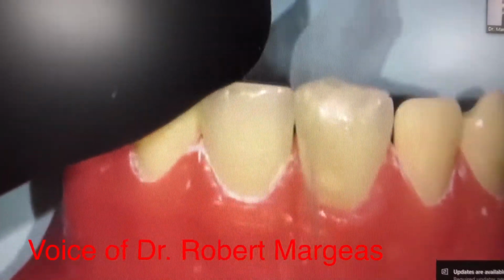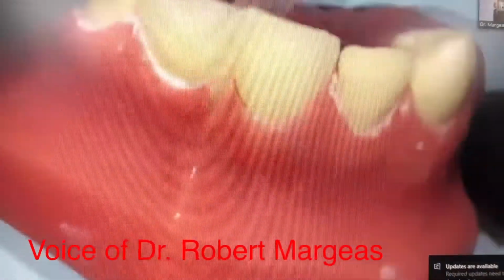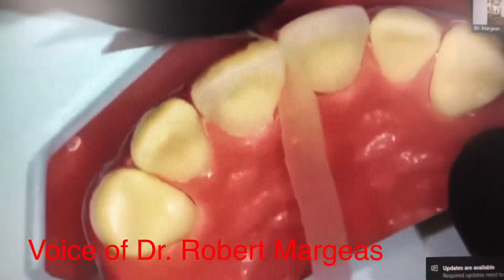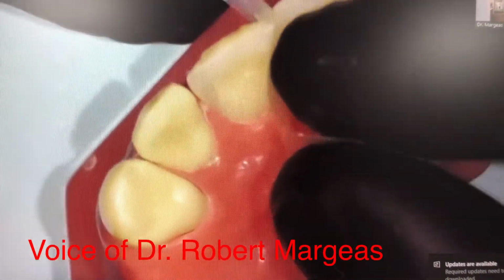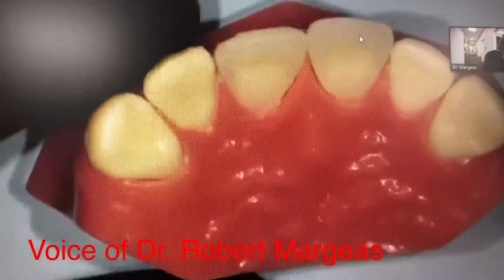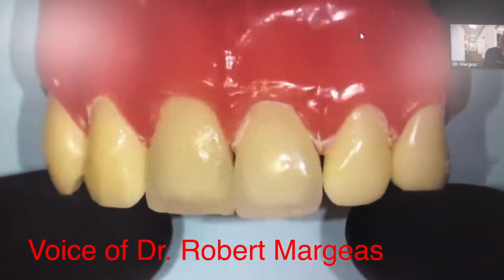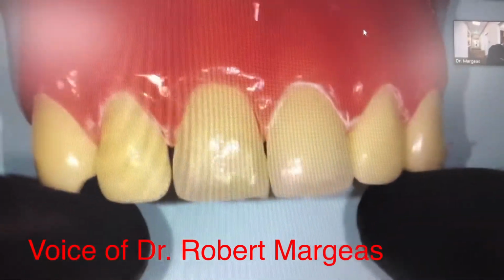And then what I'll do is I'll cleave this off like that. And then this is my first pull through, okay? So I take my instrument here, my matrix, take my finger, I pull, push, pull, push, pull, push, and then peel it off like that. So I don't have any overhangs at all. And you can see how that will create that same translucency.